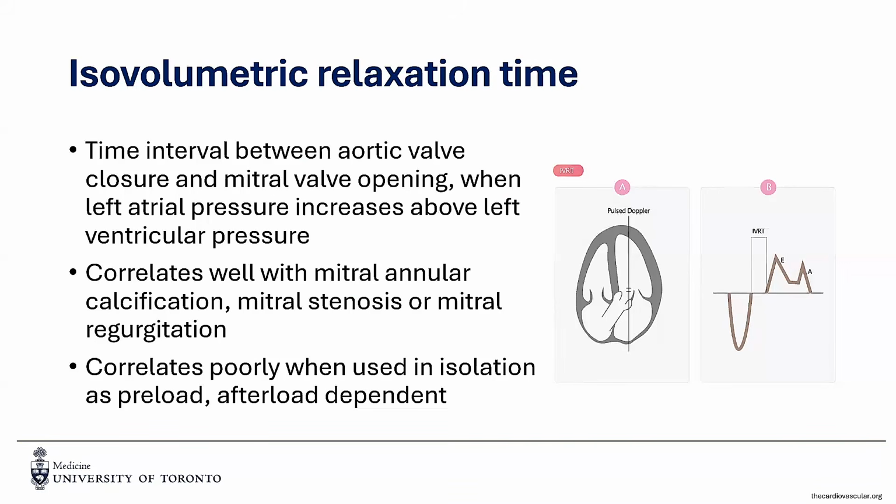Obviously, again, the main limitation in these situations is that IVRT is also not super useful in isolation because it also is dependent on both the preload as well as the afterload.